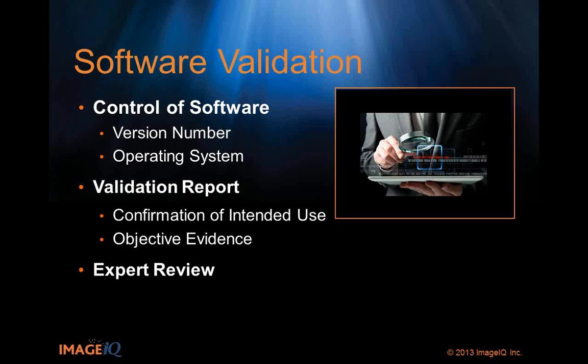That's great, but the worst thing you can do is assume that the vendor you're using has validated the software, because you might think, well, it's Siemens, they've gone through and validated it, it has to be right. You'd be surprised on certain things that they haven't gone through and actually validated. So go through your own process. It's not that hard. That's right.